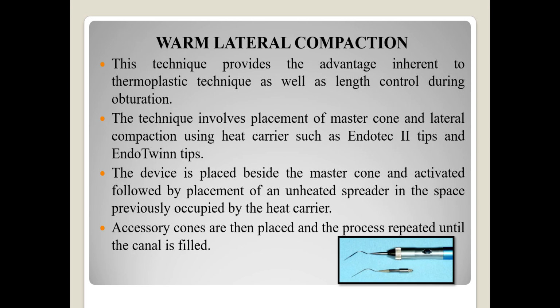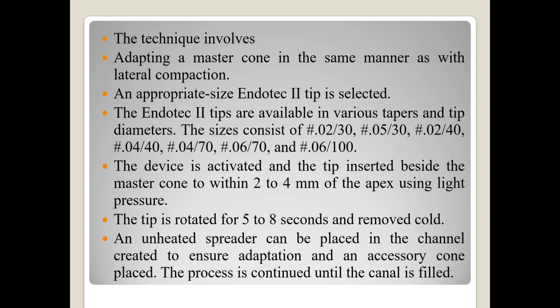Coming on to the warm lateral compaction, this technique provides an advantage inherent to thermoplastic technique as well as length control during obturation. The technique involves placement of master cone and lateral compaction using heat carriers such as Endotec 2 tips and Endo Twin tips. The device is placed beside the master cone and activated, followed by placement of an unheated spreader in the space previously occupied by the heat carrier. Accessory cones are then placed and the process repeated until the canal is filled.